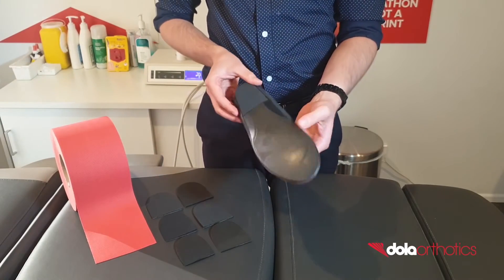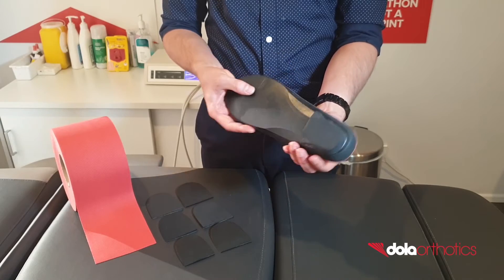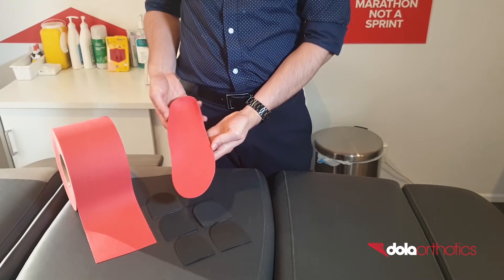This can be used for conditions including lateral ankle instability, peroneal pathologies and flexible PES CAVUS foot types.